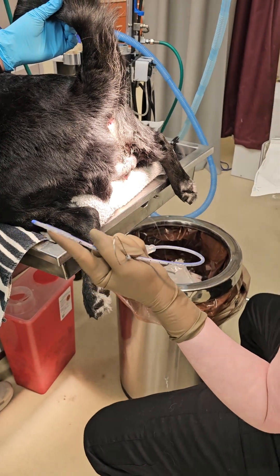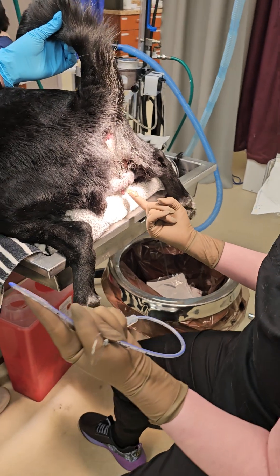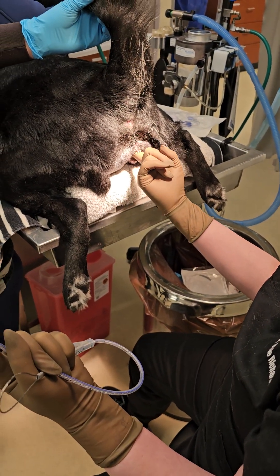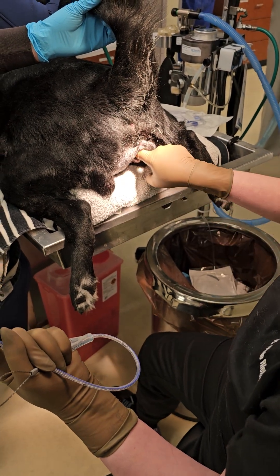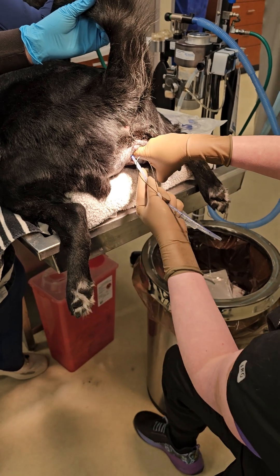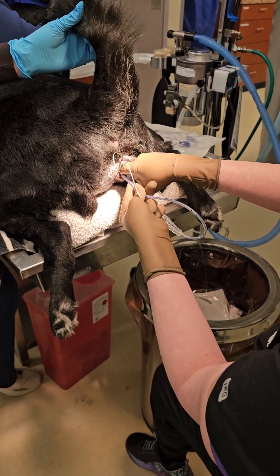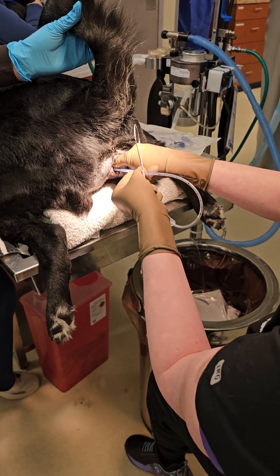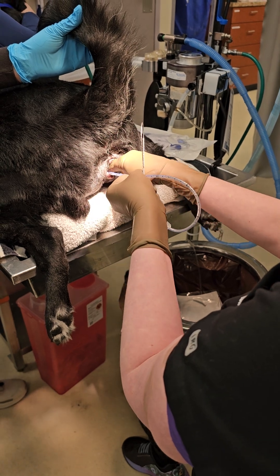The next thing I do is lube up my digit and insert first. I like to go up and into the vaginal vault and then turn my finger to where I can feel the brim of that pelvis. Then I'm going to insert my urinary catheter gently under that finger and direct it from there.